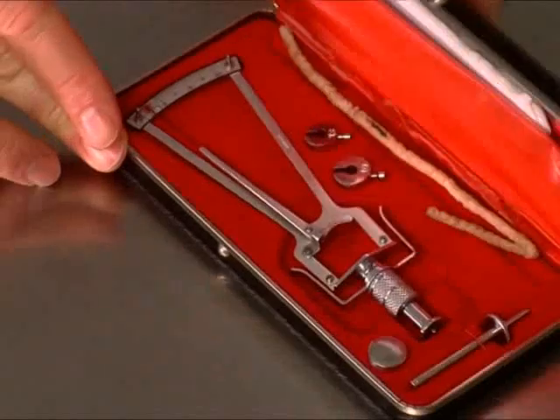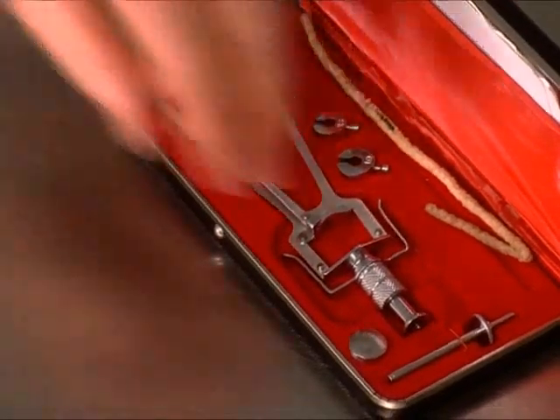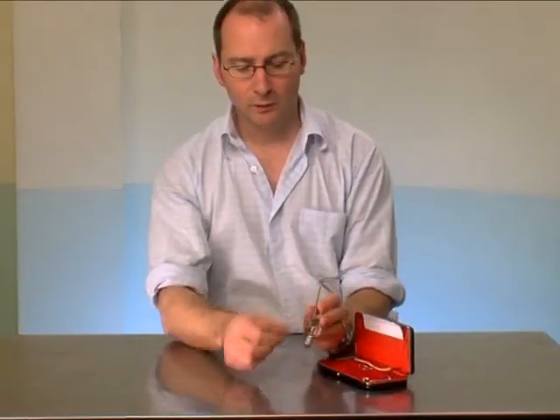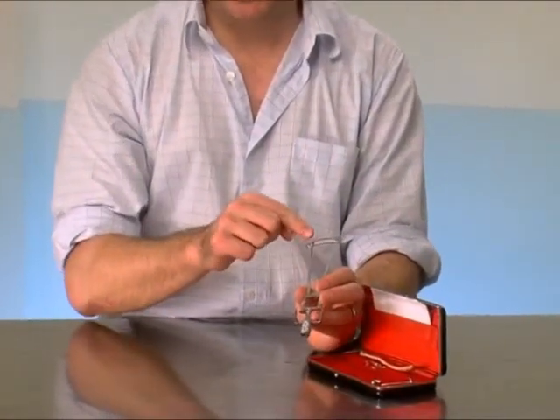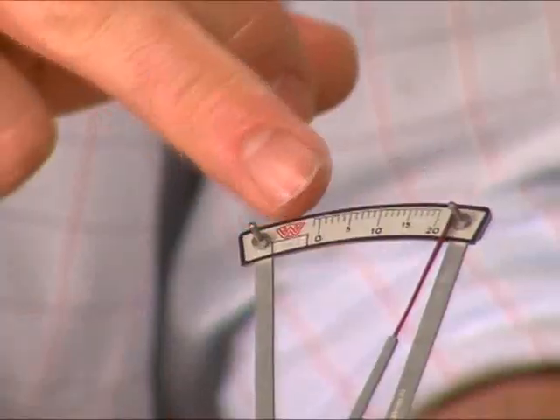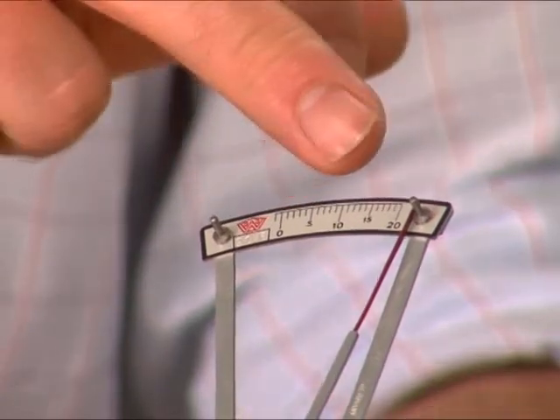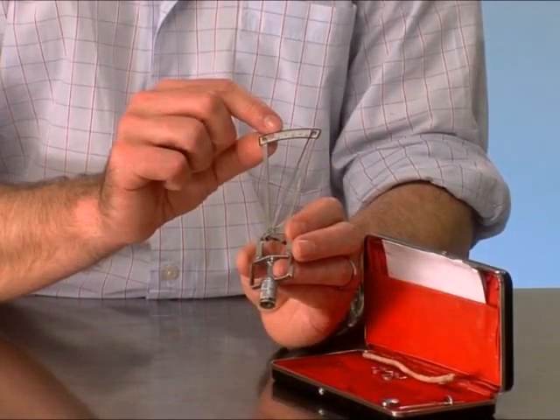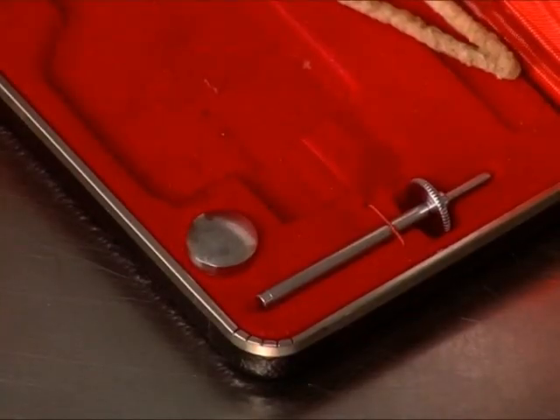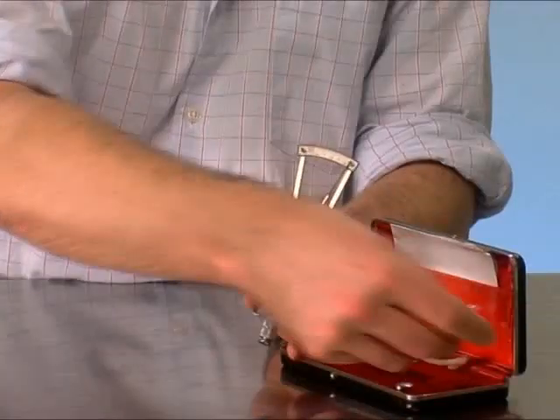Well, the Schiotz tonometer is generally more accessible to the private practitioner on the basis of cost, but it does require maintenance and a bit of practice to get consistent results. We have the basic gauge here. The Schiotz tonometer is an indentation tonometer, and basically the lower the number, the more difficult it is to indent, and therefore the higher the intraocular pressure. So it's inversely related. The next component is the plunger.